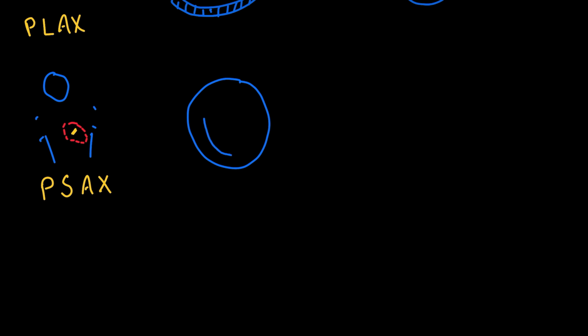So this is the left ventricle. And then you'll see the right ventricle up here off to the side. And you'll see papillary muscles. I'm going to shade in the left ventricle here. And let's label our left ventricle and our right ventricle. And these are our papillary muscles.